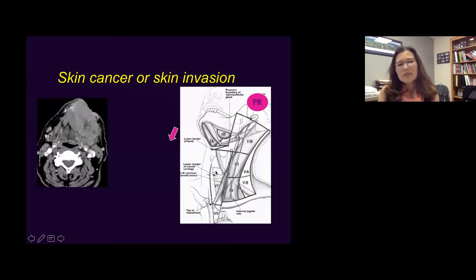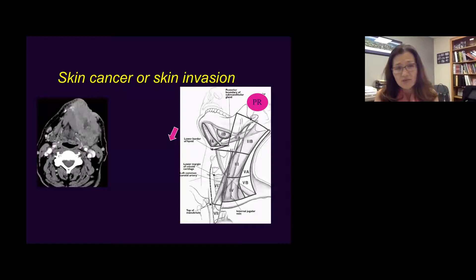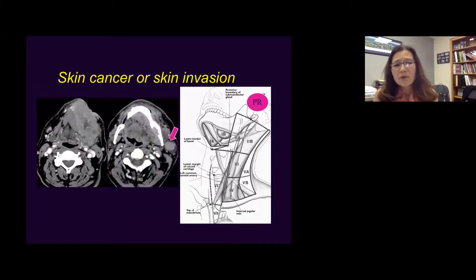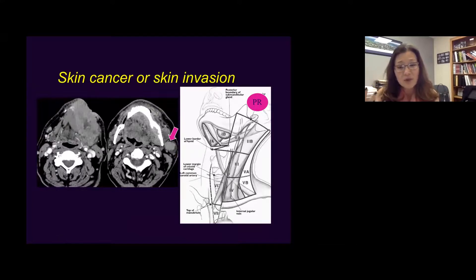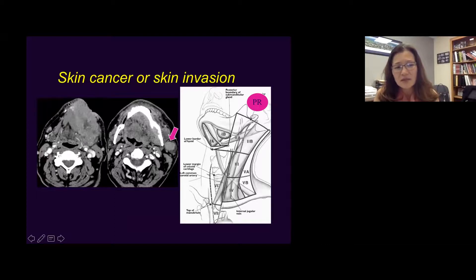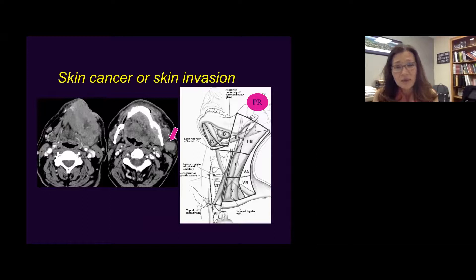When you have a large cancer spreading to the skin — dermal invasion — you often see involvement of the parotid lymph nodes. Because of facial or scalp structure, lymphatic drainage goes to intraparotid lymph nodes. So when you see a mass invading the skin, like this large oral cavity cancer, and you see a lymph node or mass in the parotid, most likely it's intraparotid lymph node metastasis rather than a synchronous parotid gland tumor.